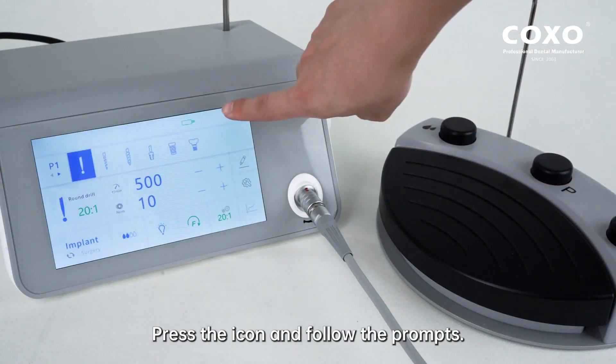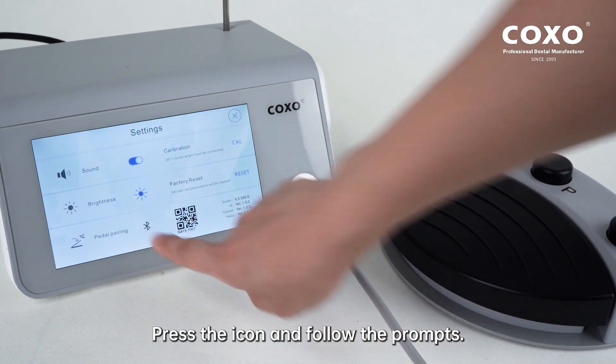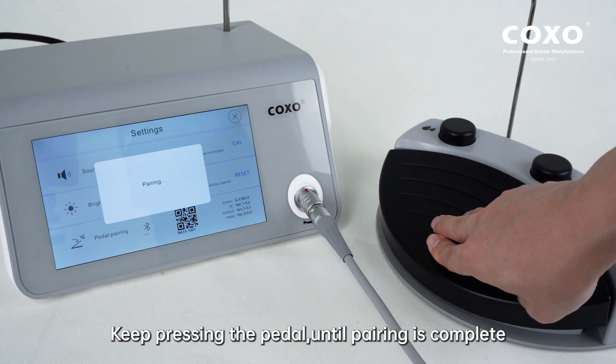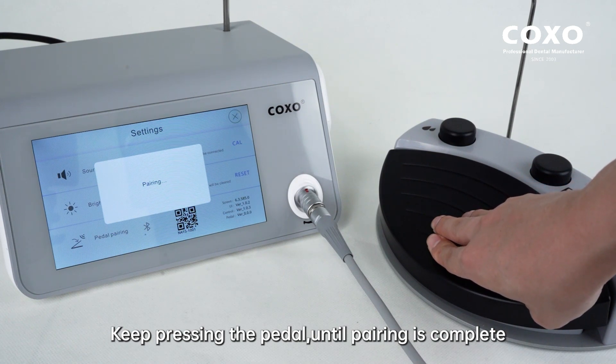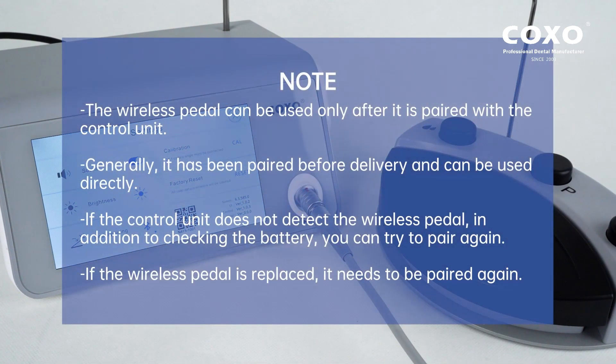Press the icon and follow the prompts. Keep pressing the pedal until pairing is complete. Note: the wireless pedal can be used only after it is paired with the control unit. Generally, it has been paired before delivery and can be used directly. If the control unit does not detect the wireless pedal, in addition to checking the battery, you can try to pair again. If the wireless pedal is replaced, it needs to be paired again.